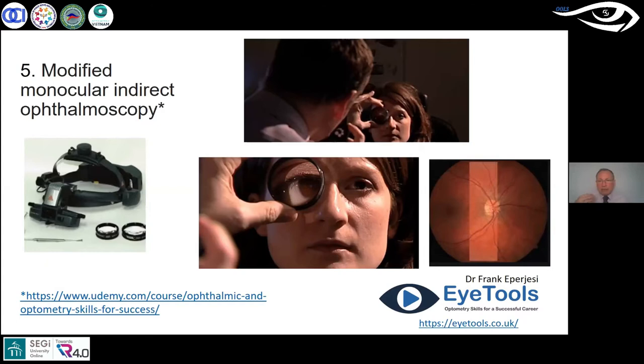No matter what I asked them to do — look in the distance, have their parents sit across the room and wave — I just can't see the optic nerve head with my normal direct ophthalmoscope. But with this technique, using an indirect lens and my direct ophthalmoscope, I'm sat back at about 18 centimeters. For children or adults who are nervous, that's great because you're not right in their face.